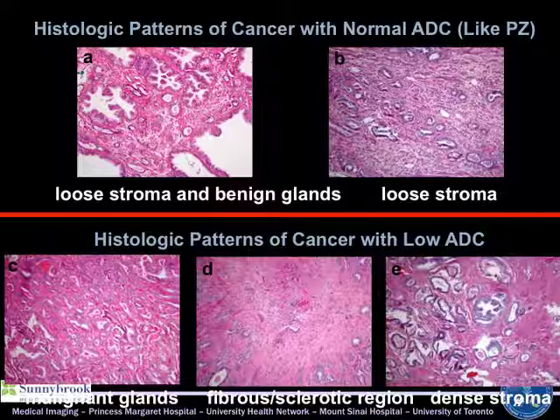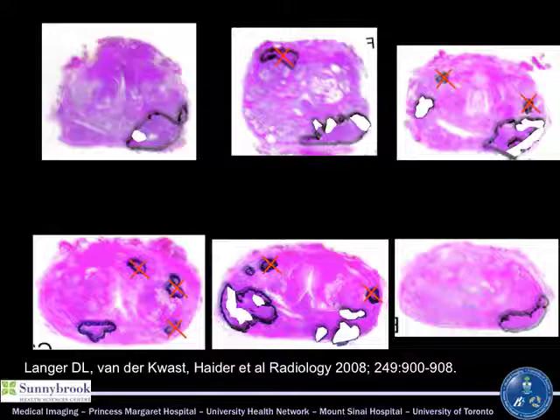They focus on Gleason score, but we don't know what the prognostic implication is if you have multiple malignant glands dispersed throughout the gland as opposed to all sitting in a nodule in one area. And we found when we started to map these tumors, these white areas are these sparse areas within tumors, that these are all different patients, a substantial number of patients had subregions within their tumor that were sparse. The good news is that these are almost always Gleason 3 pattern.